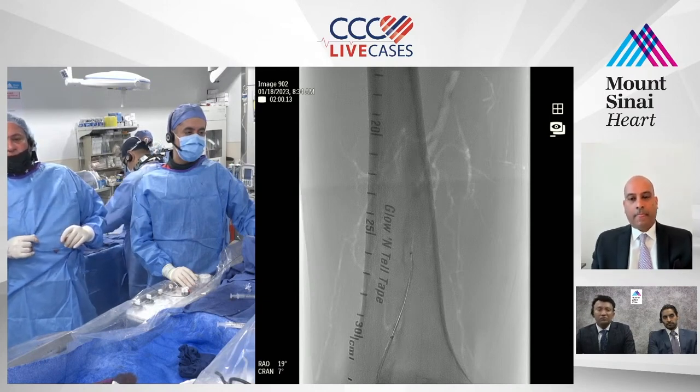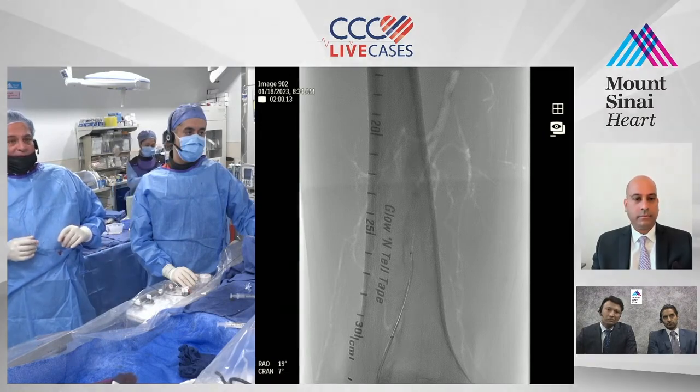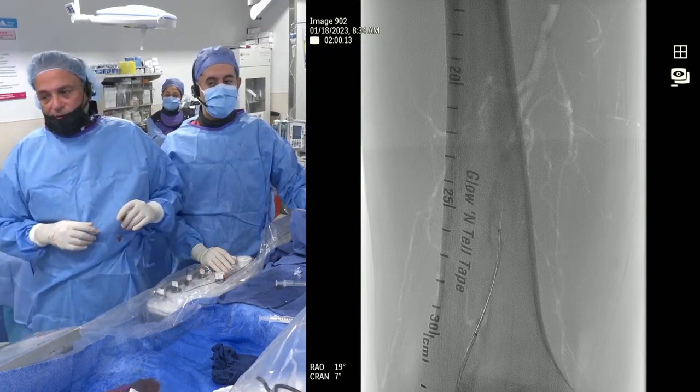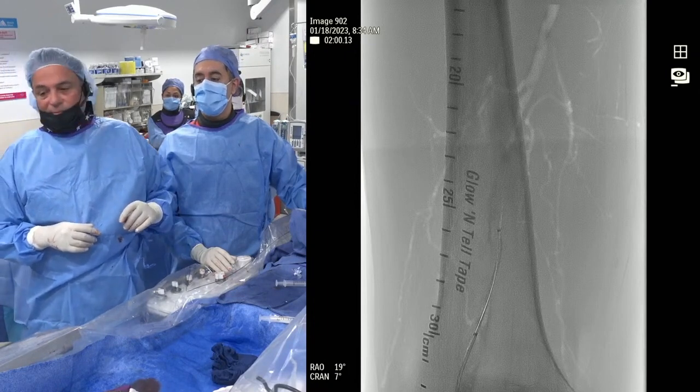035 Glide, please. So that's why I'm just going to try. I don't want to lose that collateral and get subintimal in that area, but I think at this stage, like we said, we're already in process here. Nothing much we can do. We're on the 035, as you say. Yeah, we already got pedal access.